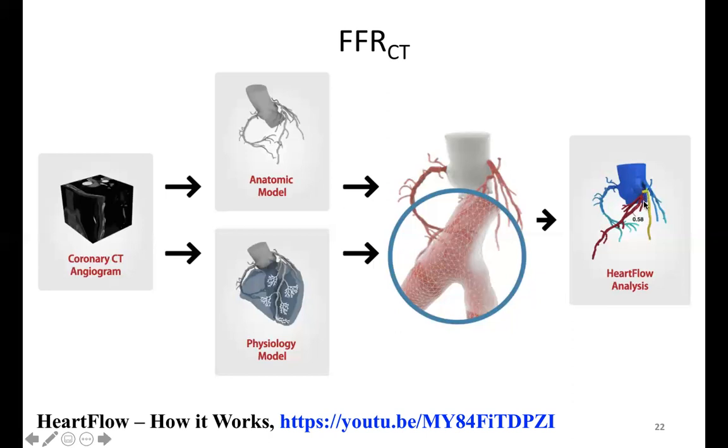You can then find out that, oh, my pressure dropped down to 0.58 distal to this lesion here. And if I put a catheter in there and measured it, you would hope that we would get an FFR of 0.58. And there's a company that does this now. They're called HeartFlow. It's FDA approved. It's now available to all patients, and we do it at UCSD quite often.